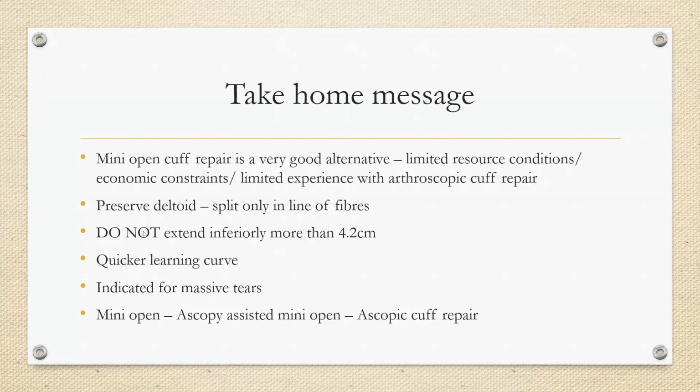If at all there are GT fractures in case of a very weak bone, at present in our tool kit, we have something called the specialized GT plates. These are plates specifically designed for GT avulsion, which have holes in the periphery for addressing the cuff tears also. So these GT plates will be like spike plates fixing the GT onto the proximal humerus, and the holes in the plate will help us in repairing the cuff. And this is possible only with a mini open.